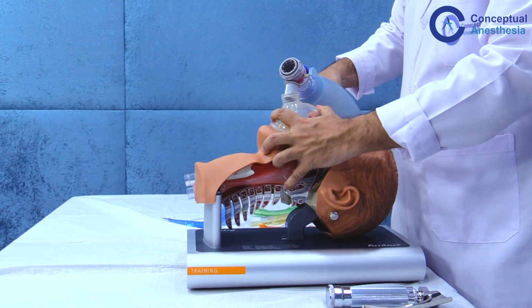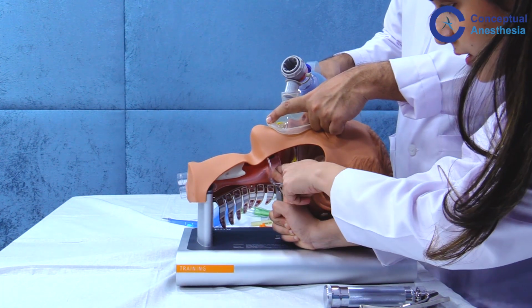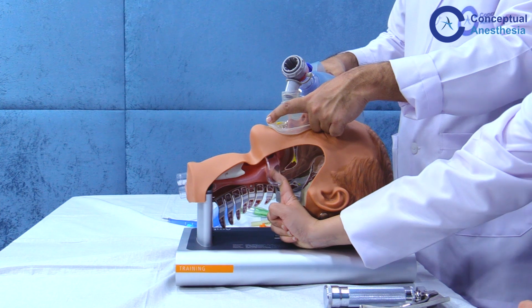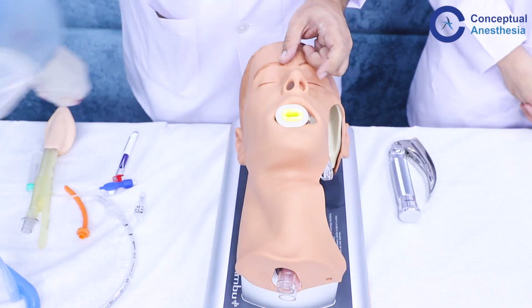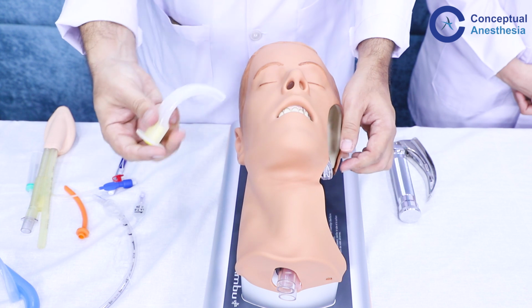So as you can see from the side, this is where the oropharyngeal airway has opened up the space between the base of the tongue and the posterior pharynx. This maintains the patency of the airway and helps in ventilating the patient. The other technique of introducing the oropharyngeal airway is directly inside as per the curve of the OPA.